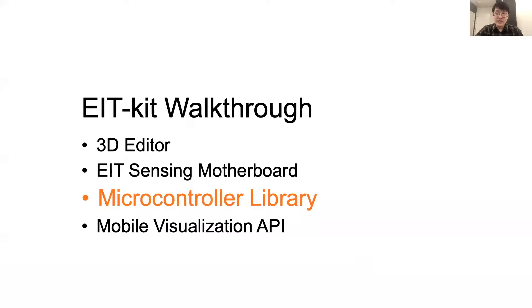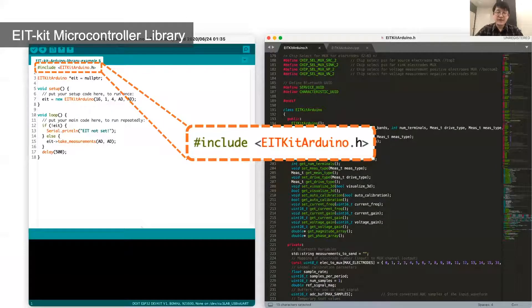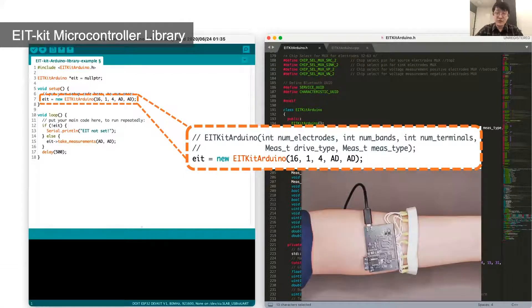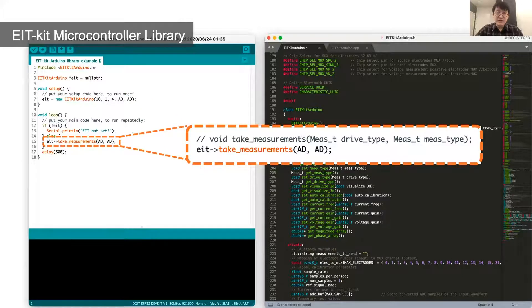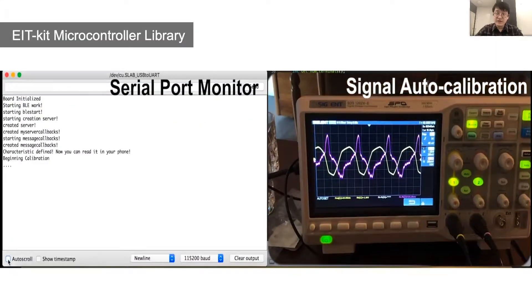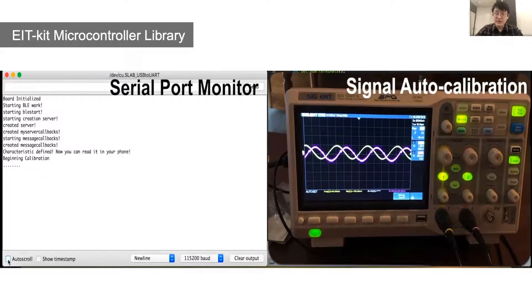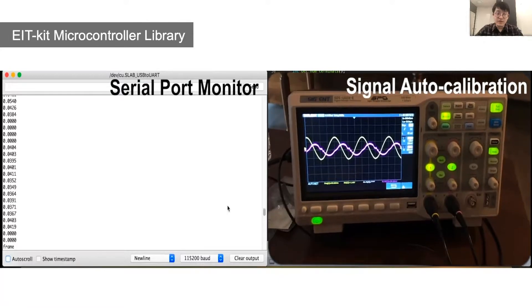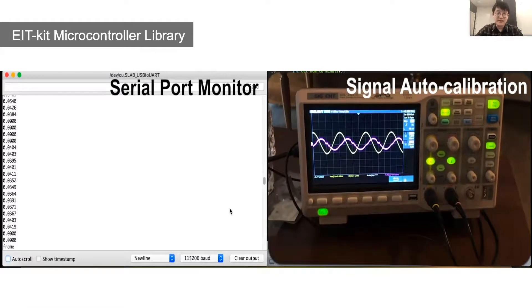Once all the hardware is set up, let's move on to the microcontroller library. Users start by importing the EIT Kit Arduino library, then construct a library object with measurement configurations. In the case of the armband shown, we have 16 electrodes, single electrode array measurement, with 4-terminal configurations. After that, users can start the measurement by simply calling the take_measurement function. As you can see on the serial monitor and oscilloscope at the bottom, the library will auto-calibrate the injecting current and voltage measurement gain for the measuring object, then start the EIT data measurements.